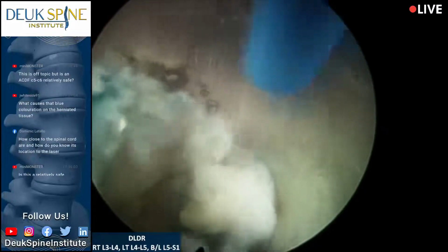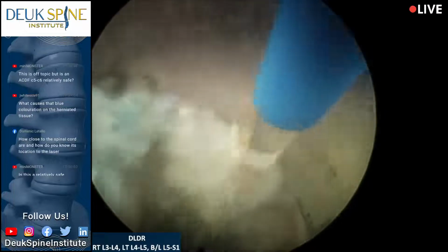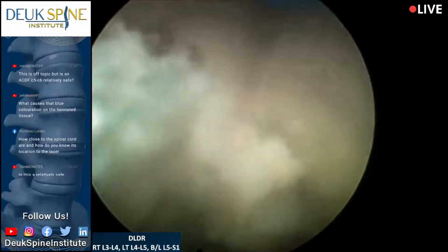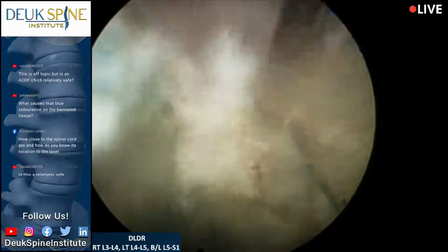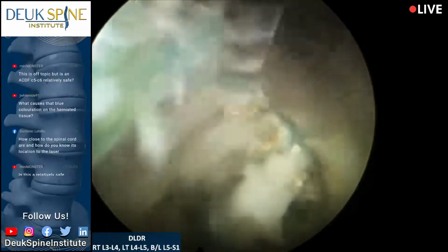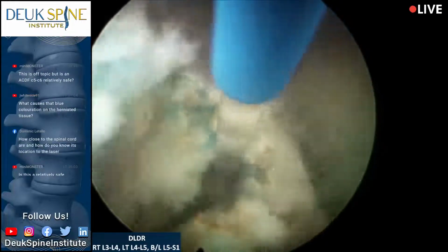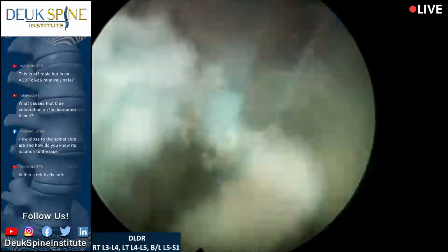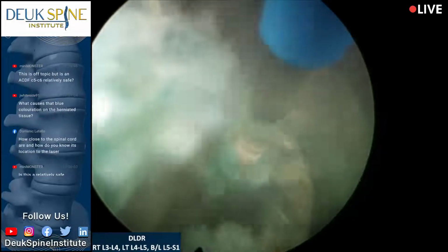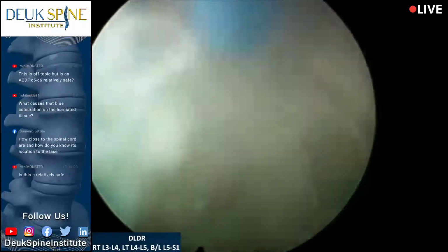Now, the cervical spine, when we do the neck surgeries on the cervical spine, we're literally just on top of the spinal cord. So we're a millimeter away. The other part of the question was about the laser. The laser, you can see, is a little glass tube. And out of the end of this glass tube comes laser energy. But the energy only goes a little way out of the tube. It only comes out 0.5 millimeter. 0.5 millimeter is a very short distance.